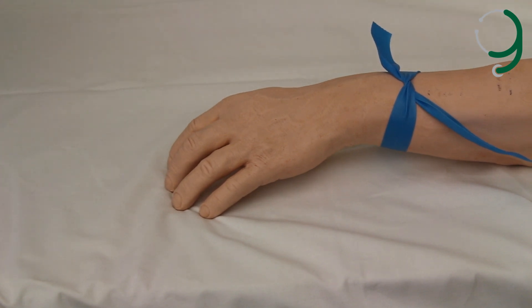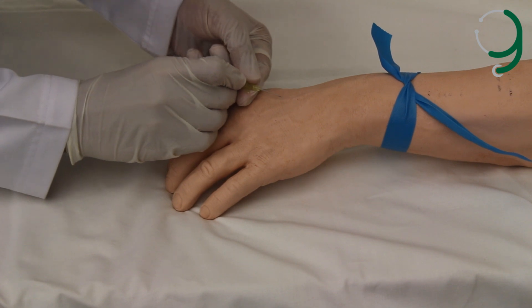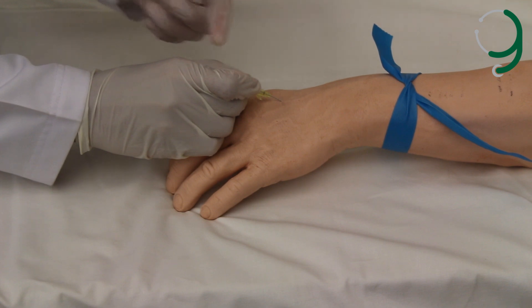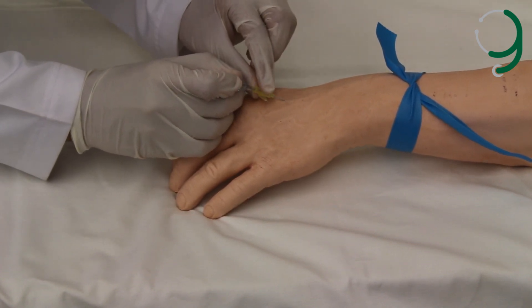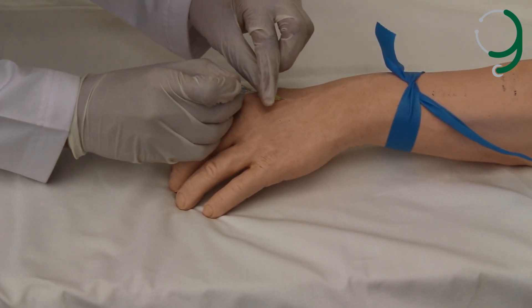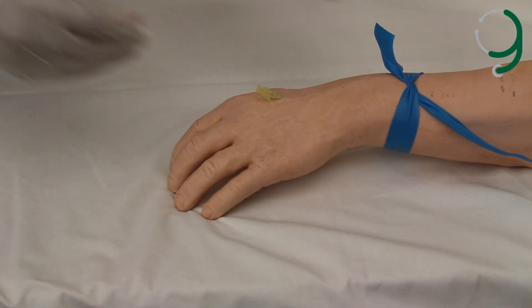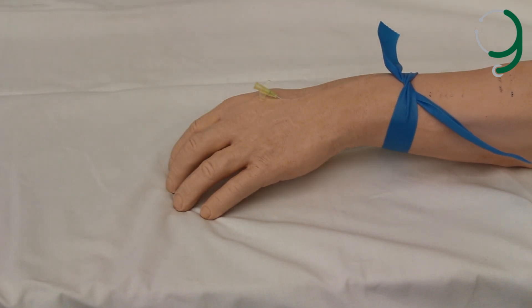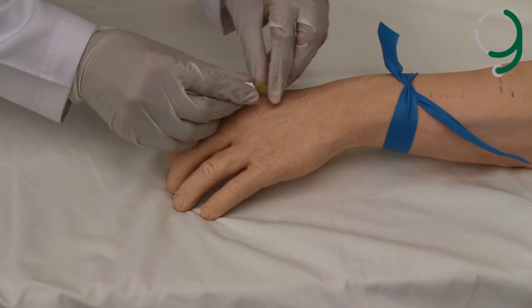Then you inject the cannula at 30 degrees. After you see the flashback of blood, you should retract the needle and continue advancing the cannula. Then you cover the cannula.